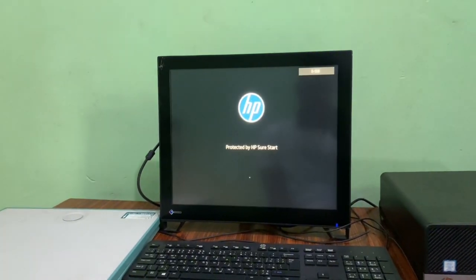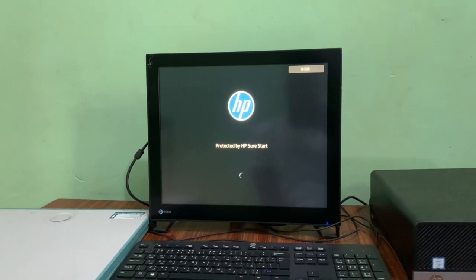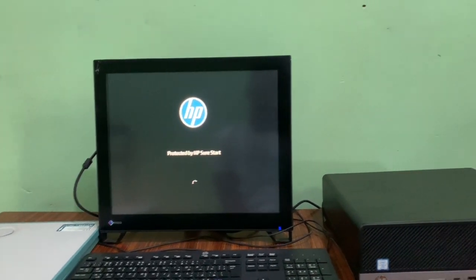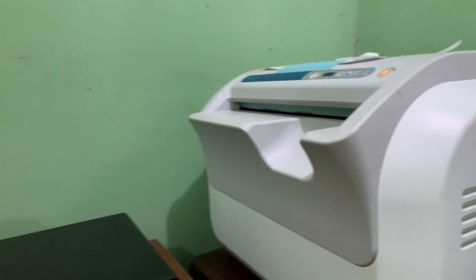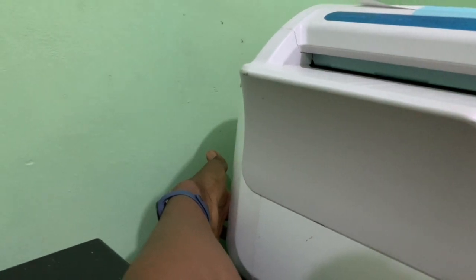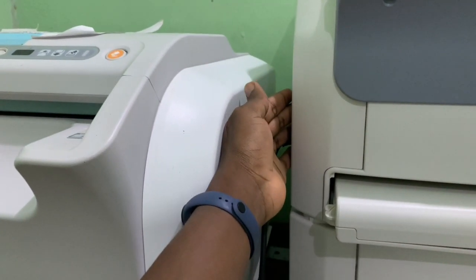When you switch on your computer, you make sure all connections are done properly. The printer is connected, the monitor, everything is connected properly. Then there's a switch by the side of the digitizer and the printer. So you switch on your digitizer, you switch on your printer.